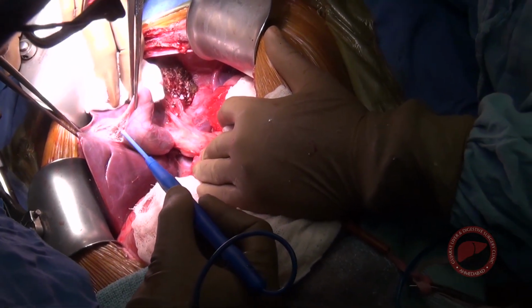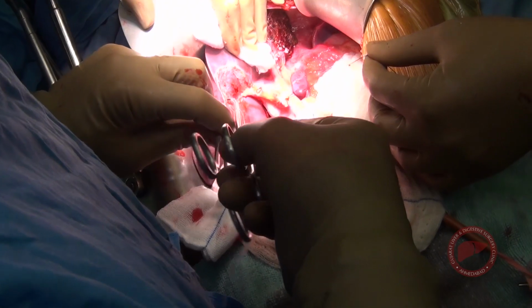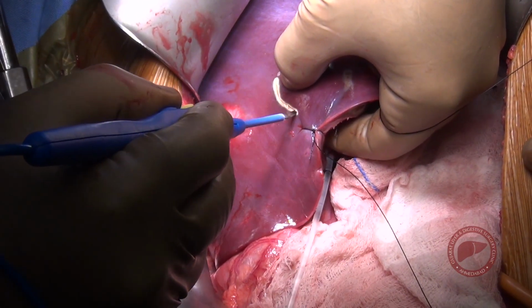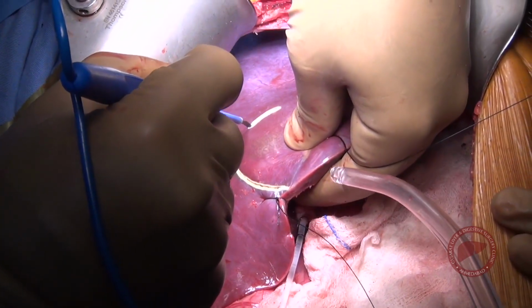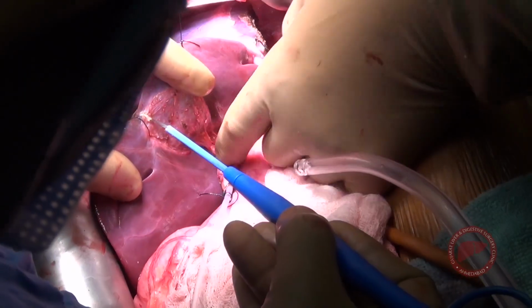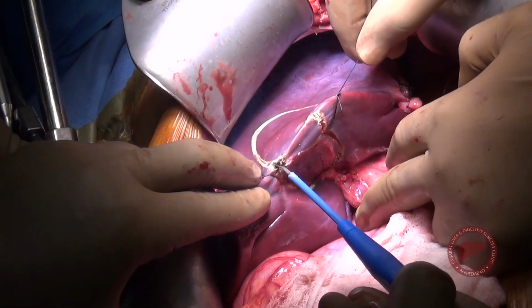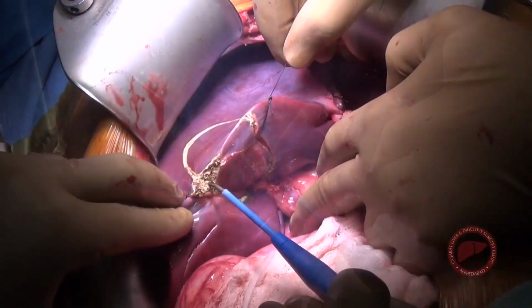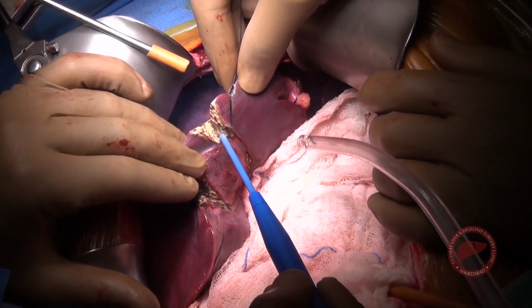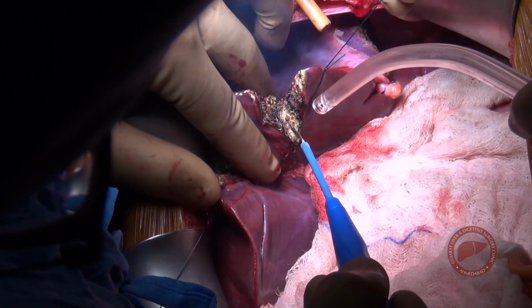Now, cholecystectomy was performed and a catheter was placed in the cystic duct. The metastasis at the base of the gallbladder was marked and the metastasectomy was performed. Parenchyma was divided with the help of diathermy and CUSA.